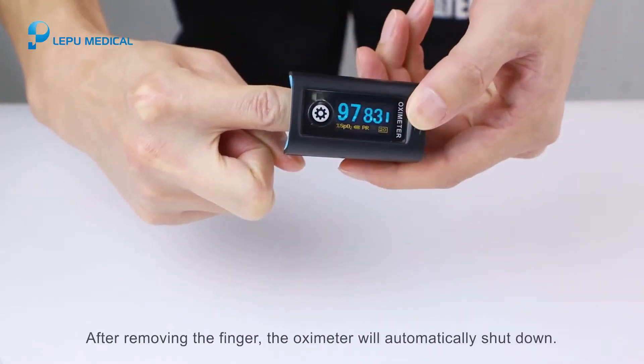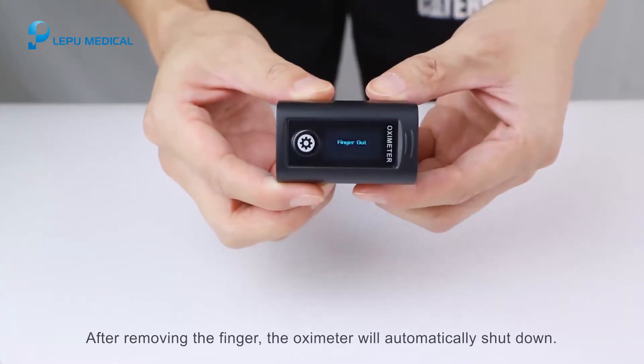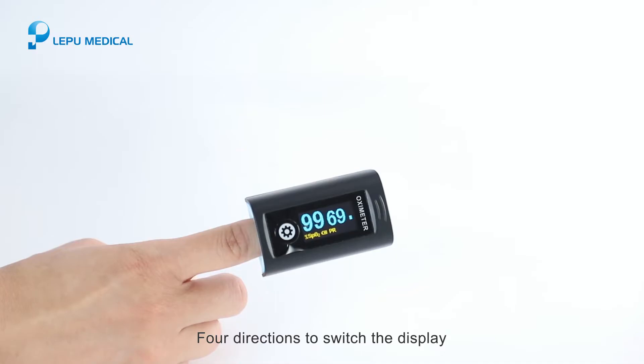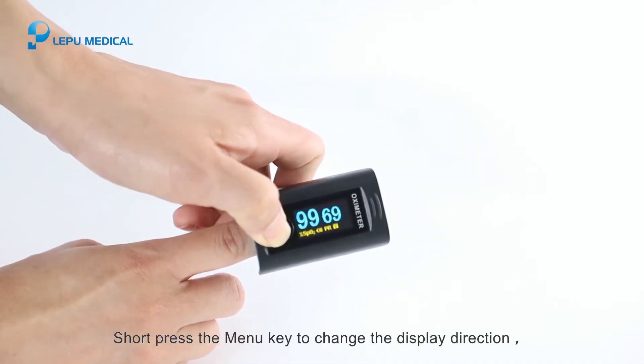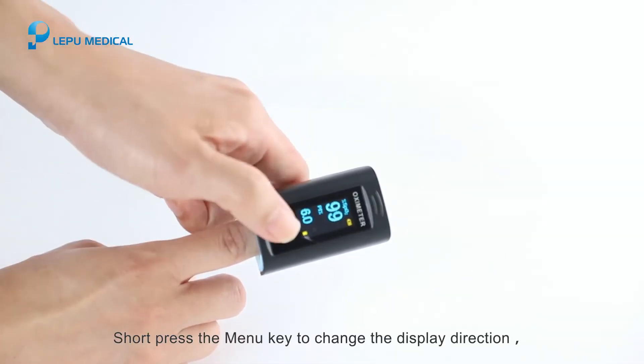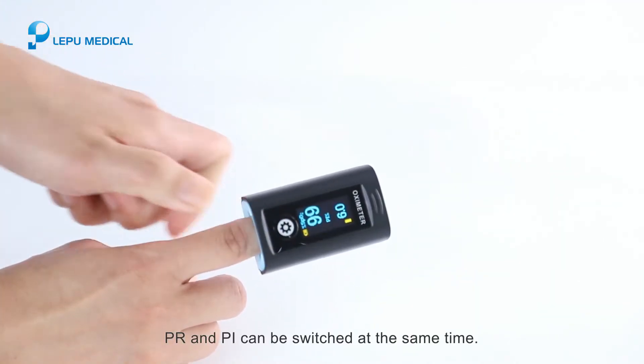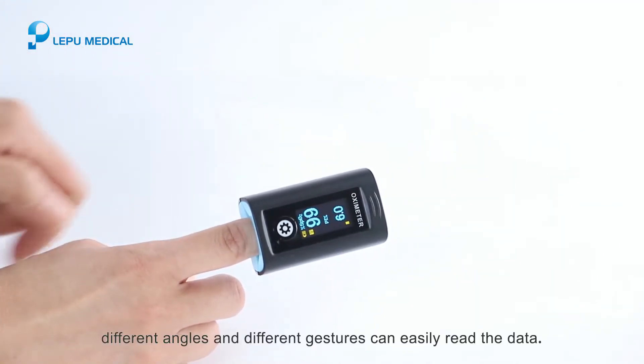After removing the finger, the oximeter will automatically shut down. To switch the display direction, short press the menu key to change the display orientation. PR and PI can be switched at the same time, so different angles and gestures can easily read the data.